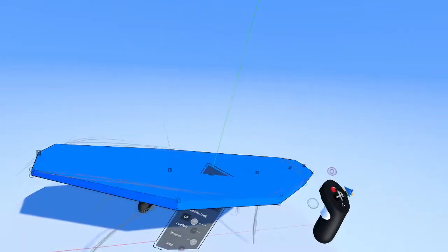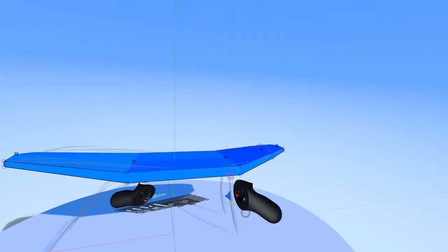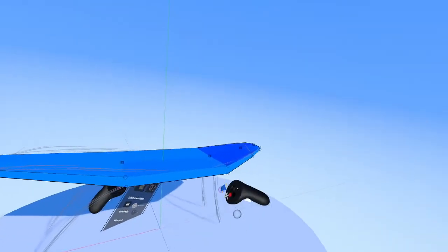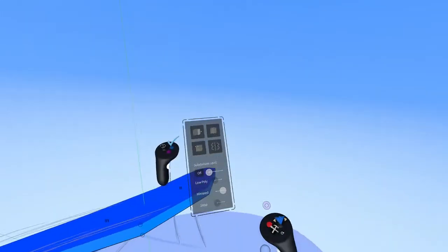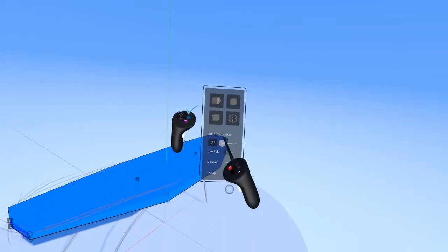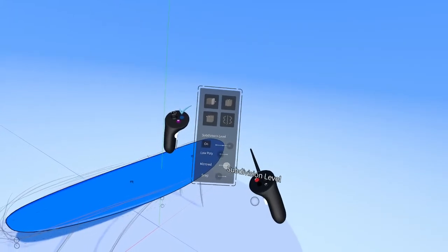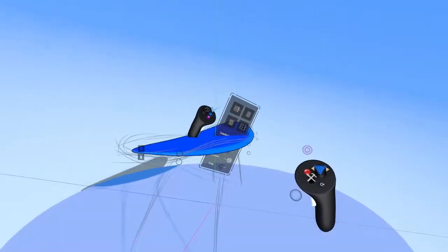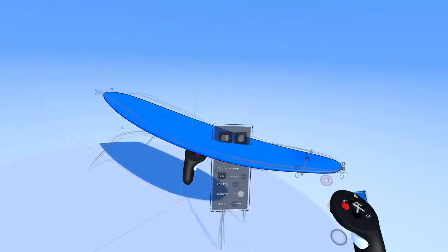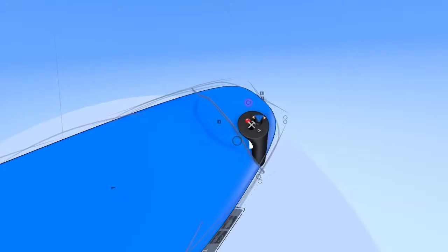Okay, so right now we have just the boxed out version of this table, and this is a good starting place for us. If we want to see what this looks like smoothed off, we can take a look at our edit panel here on the left-hand controller and turn on this option here that says Subdivision Level. So if we swing that all the way to the right, we get this surfboard looking table, and that is the raw shape that we had with smoothing applied to it. So it's looking pretty good.